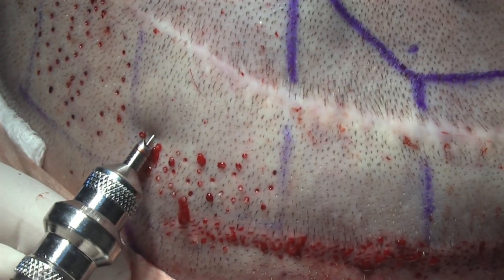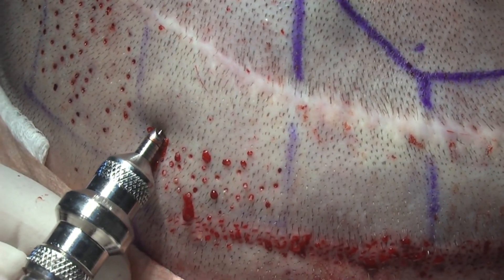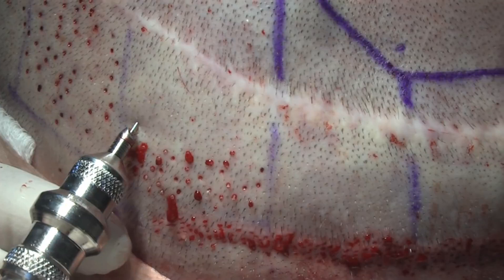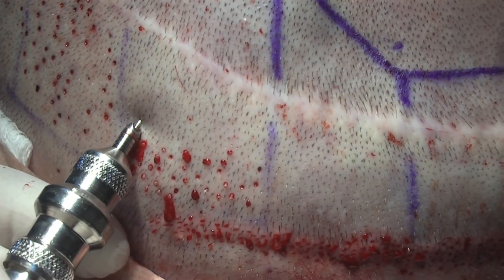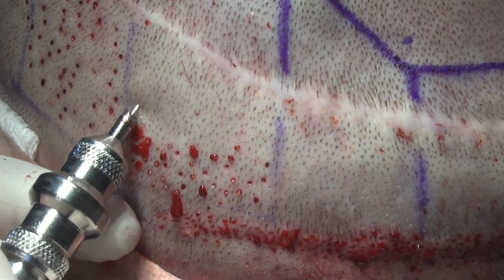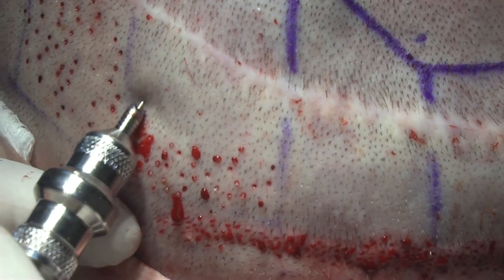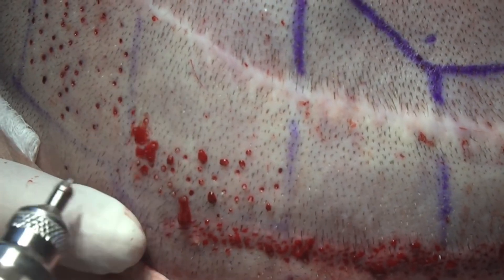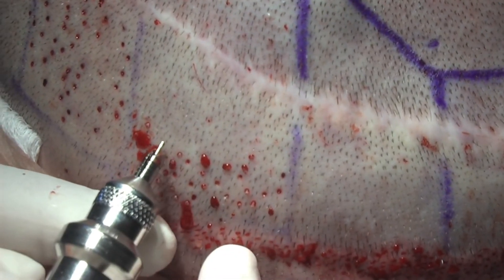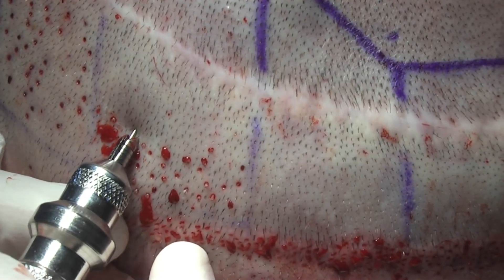The technique here is to first get a bite into the skin with rotation. I begin by rotating prior to placing the instrument on the patient's scalp. This prevents spin-off of the punch.